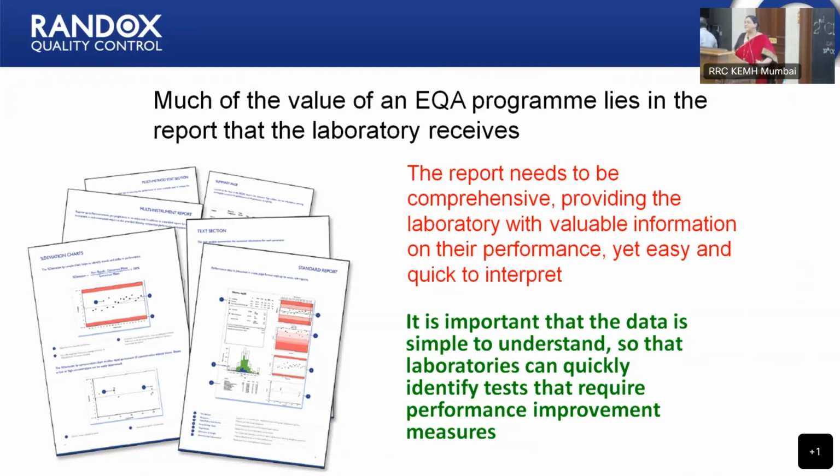Now, what is a blind sample? The sample is called blind because the concentration of the sample is not known to the laboratory that has received the sample. The laboratory runs the sample similar to a patient sample. They submit the results back to the PT provider or EQA provider.